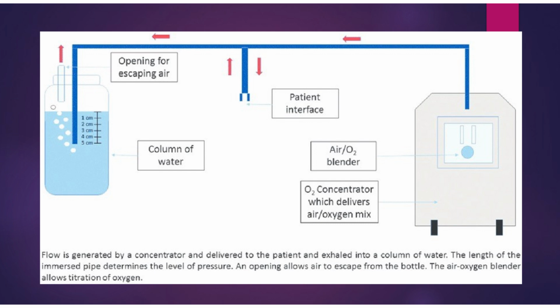And like Elvis has said, the lower the flow on the oxygen concentrator, the better the ability of the machine to produce the oxygen. So if you are testing your concentrators with an oxygen meter, you need to test them at 2 liters per minute, so you know the full functionality of your machine. And if you do have time, those oxygen meters, like Elvis has described, could be used to accurately measure the FiO2 for your actual individual patient. Thank you for those suggestions, Elvis.